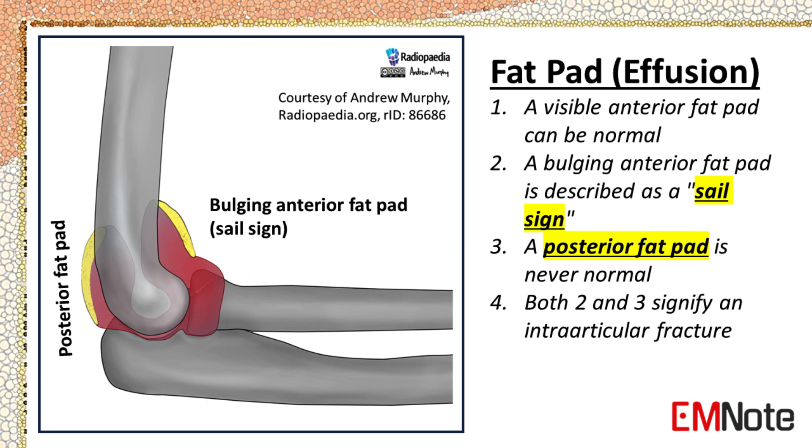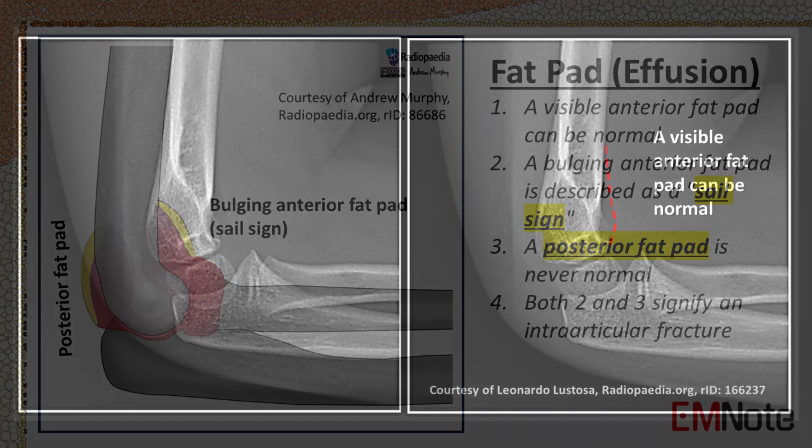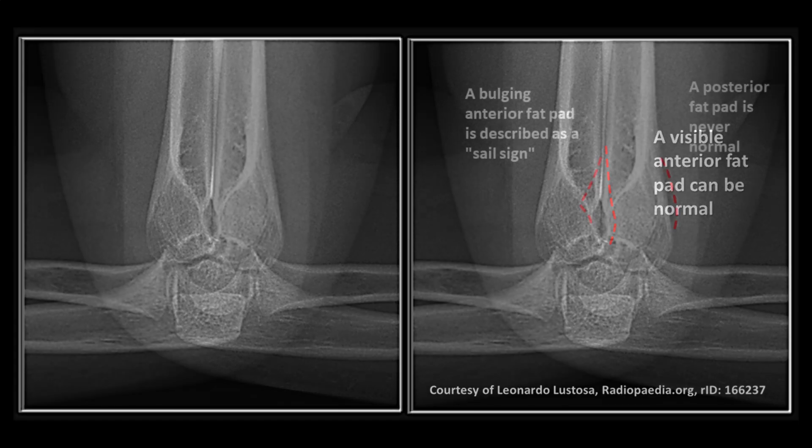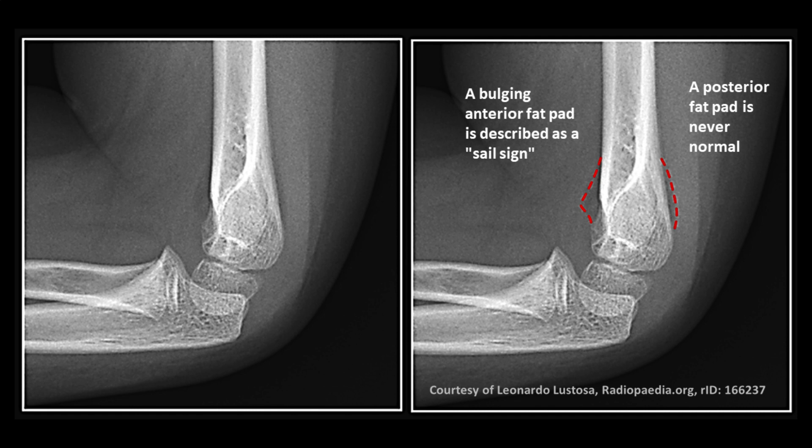To summarize: a visible anterior fat pad can be normal, but a bulging anterior fat pad is abnormal and is described as a sail sign. A posterior fat pad is never normal. Both a sail sign and a posterior fat pad signify the presence of an intraarticular fracture. This radiograph shows a visible anterior fat pad, which can be normal. This radiograph shows a sail sign and a posterior fat pad, which signify the presence of an intraarticular fracture.